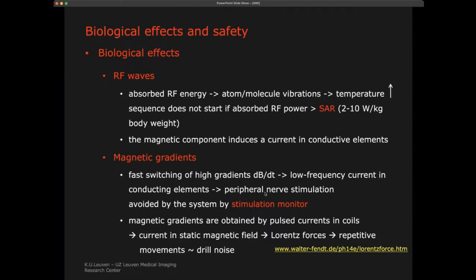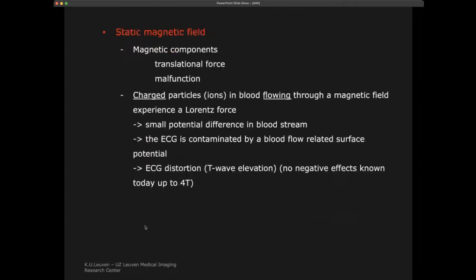The other thing, for those that have had an MRI scan, is that because we have these very fast switching gradients, all the parts of the scanner start to vibrate in some ways. And actually, an MR scanner, when these gradients are on, is extremely noisy when you're in there. So a patient needs to wear headphones, potentially with noise cancellation, because of all these very rapidly changing magnetic fields and the forces induced by this. These become extremely noisy environments, and that's sometimes a problem also for patients.